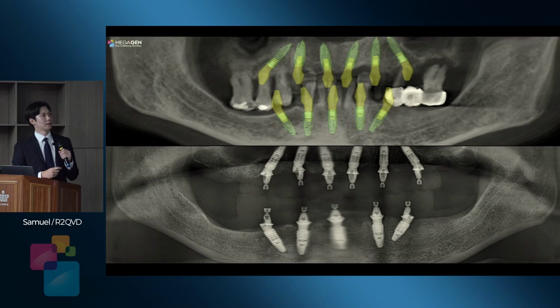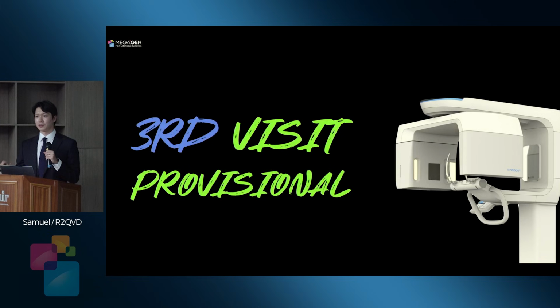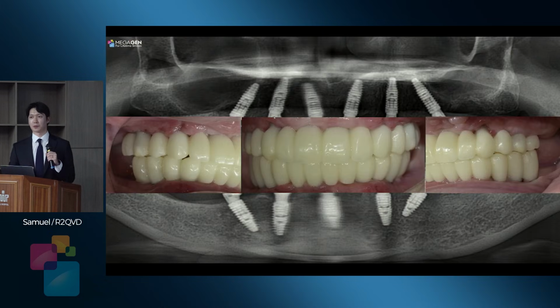Then after that, the patient doesn't want to do more treatment, because upper and lower and a little bit of reduction for her is a very hard day. So she wanted to make a temporary next week. So of course, why not? So after surgery we just scanned it. Then using that VD solution, the QVD solution, we just make a temporary like this.